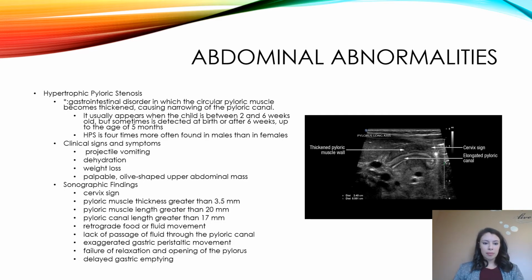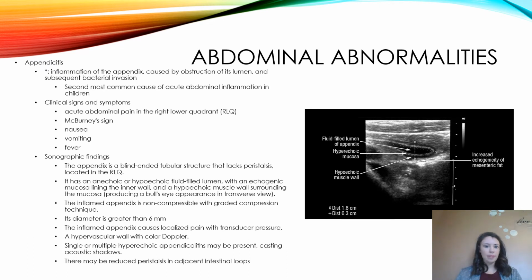So what I meant by cervical sign, you can see here, the cervix sign, right there. And you can tell how inflamed and thickened the muscle is and how elongated the pyloric canal is. If you look at these, you can see that it is greater than 20 millimeters.